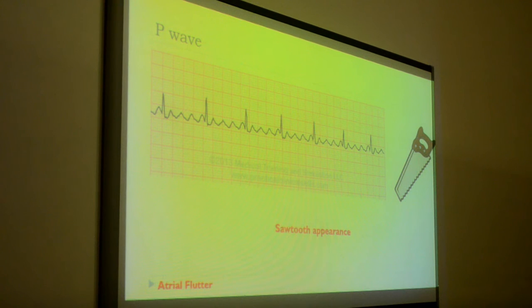Yes, you had a question. Yeah, it's still confusing because the flutter is the one causing the signal, not the SA node. When we do this carotid sinus massage, yes, the SA node will be stopped, but still the flutter will continue. This isn't the SA node firing. This is the... for example, if you have.